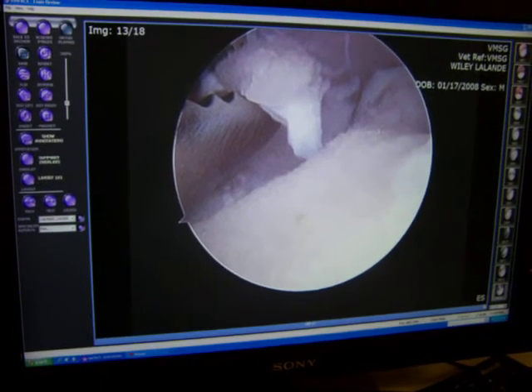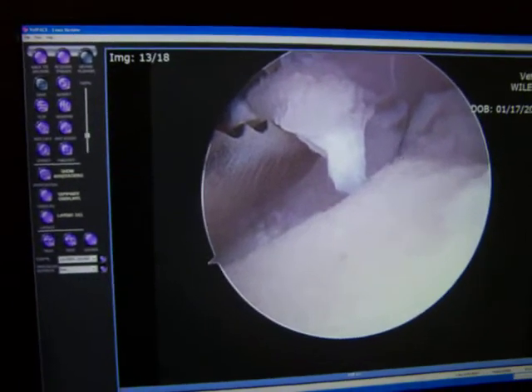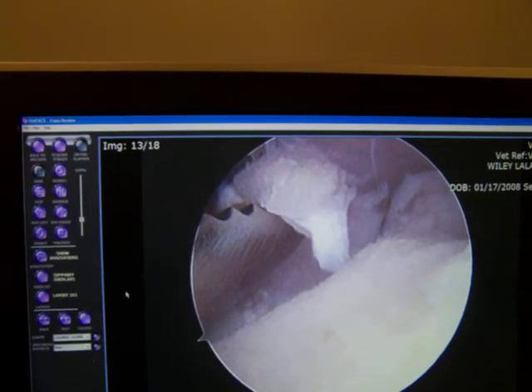Here I am grabbing another piece of fragment. This is the bone underneath — you can see where the flap was sitting. It drops down — that's the edge of the crater right there. This is the whole crater it came out of, and I'm just pulling out the last piece of the flap there.